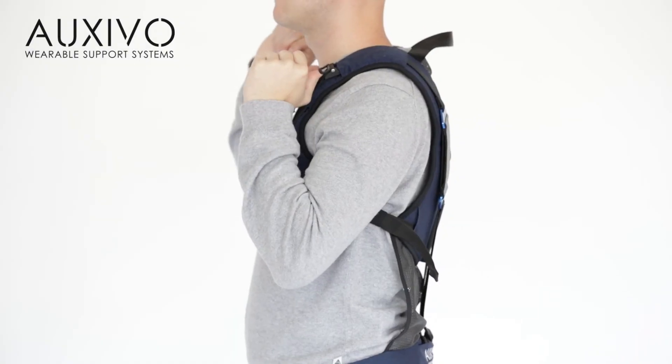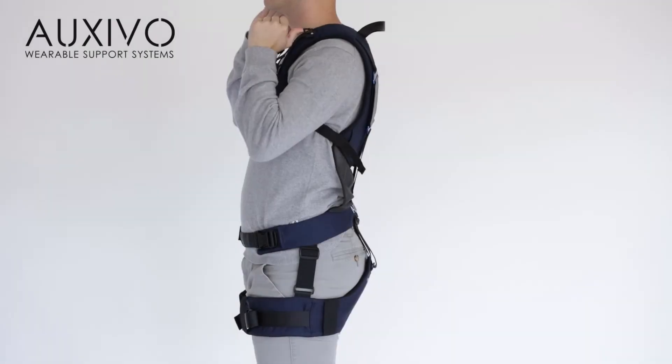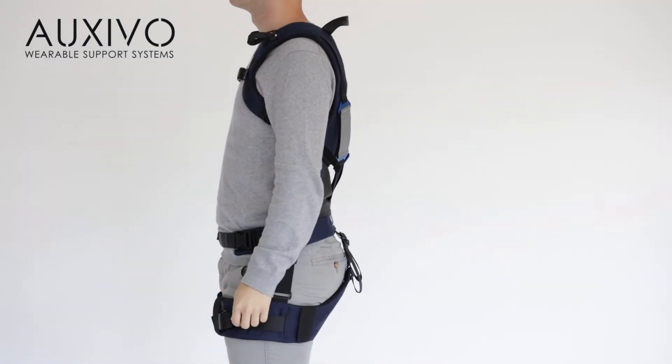When you momentarily don't need support or are on a break, it is important to deactivate the lift suit to ensure that you can move freely. This can be done by releasing the activation buckle and leaning forward or moving your legs.